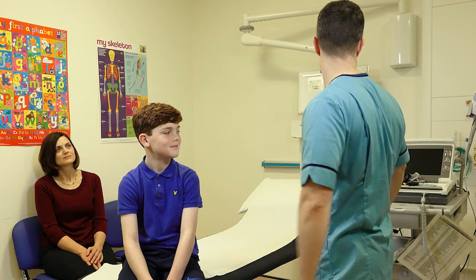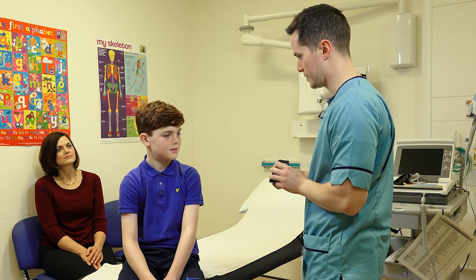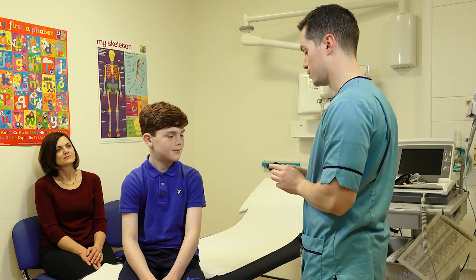Hello, I'm Sam and in this film I'm going to be showing you what it's like to have an ambulatory ECG done. Hello Sam, my name is Nick and I'm going to be fitting the ambulatory ECG to you today. It's a little monitor that looks like this. It's attached to your chest via some electrodes and basically what it does is it records your heart rate and rhythm for the next period of time.